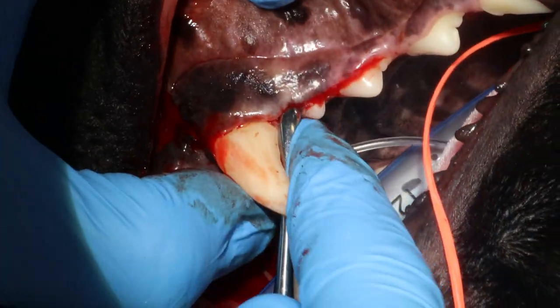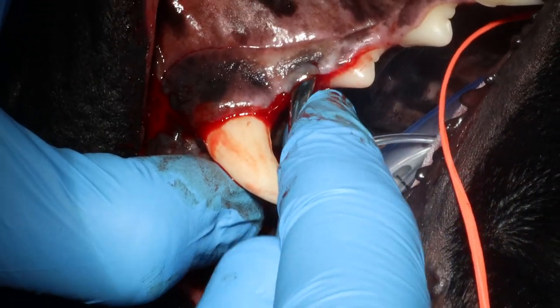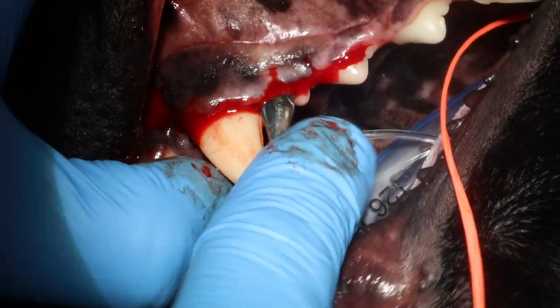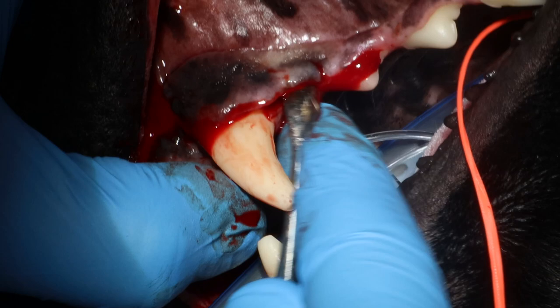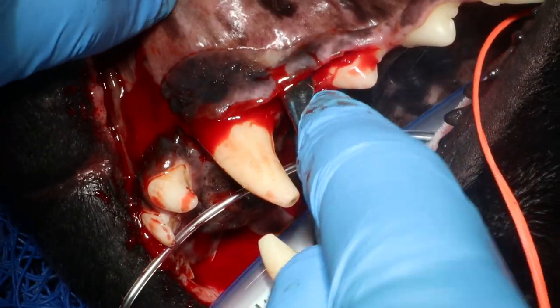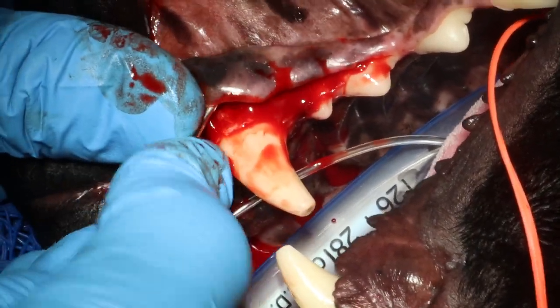There are many flap designs to remove a tooth, and most of them are acceptable. In this case I'm including these two teeth, and once you put the flap back the gingiva will reattach to the teeth. Just work slowly with a firm push against the bone and a twisting motion. You want to get everything off the bone — all the soft tissue should be pried off the bone.